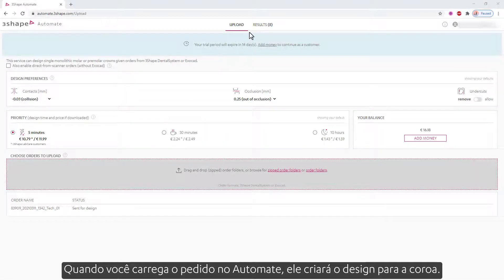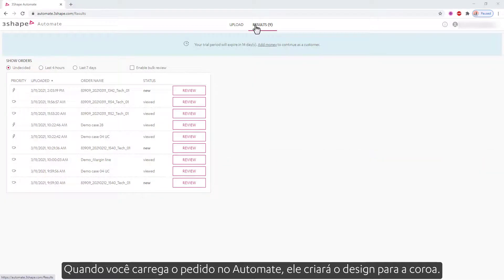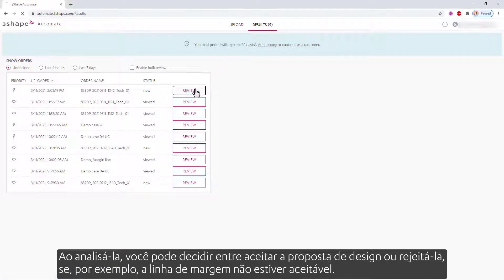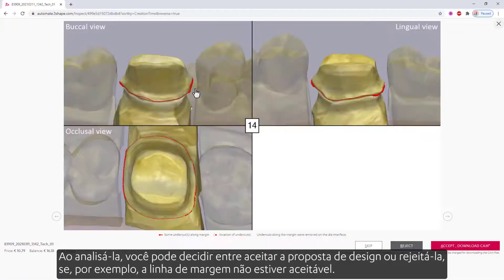When you upload the order into Automate, it will create the design for the crown. While reviewing it, you can decide to accept the design proposition or reject it — if, for example, the margin line is not acceptable.